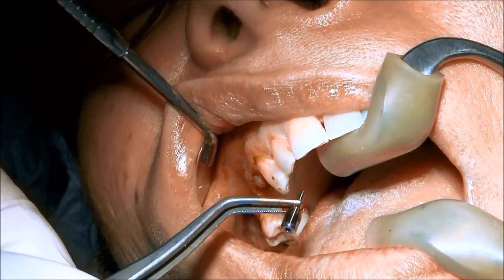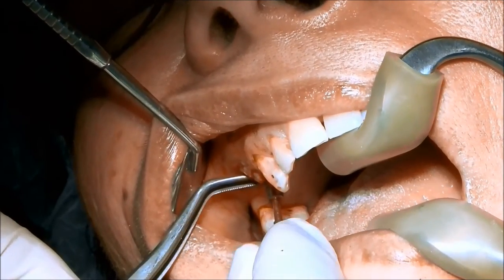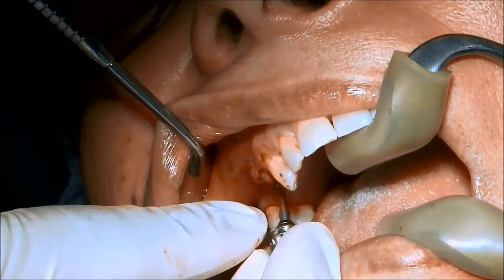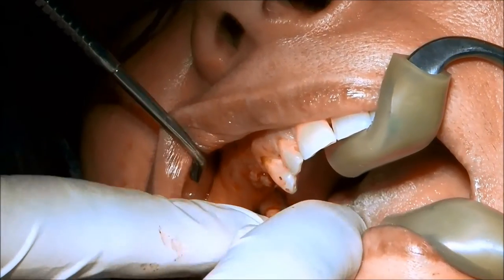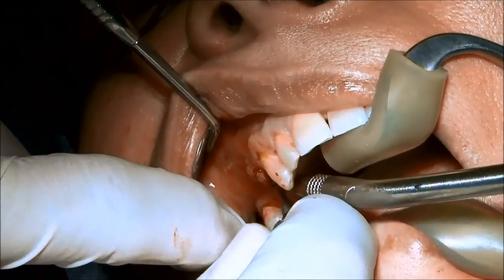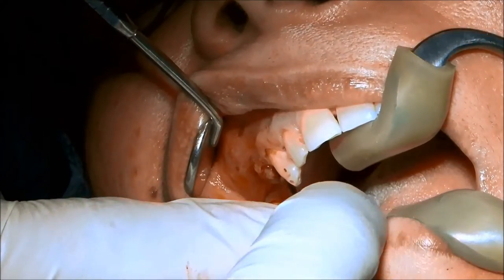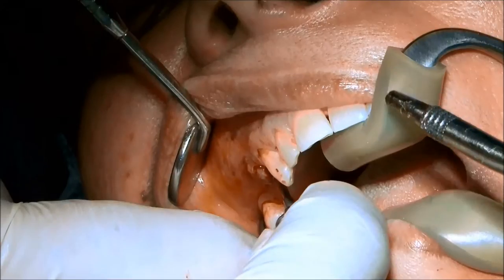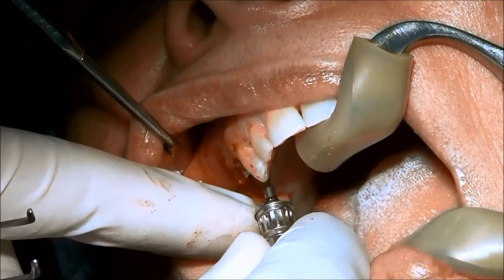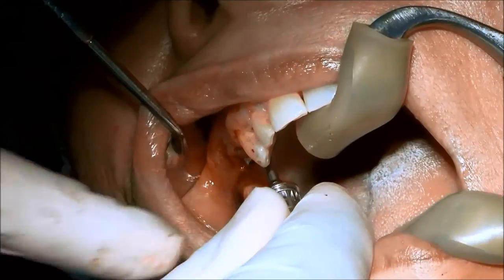We're going to clean the internal part of the implant before we position the healing abutment. Here I'm utilizing my two hands — once you drop it, it's very easy to secure. Here is the second healing abutment in place and I'm going to be torquing it now.